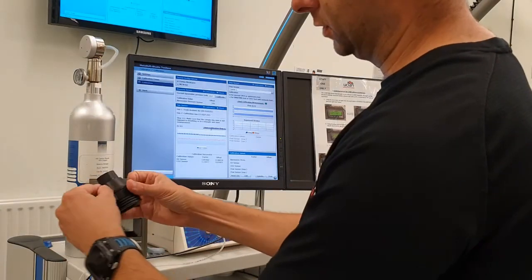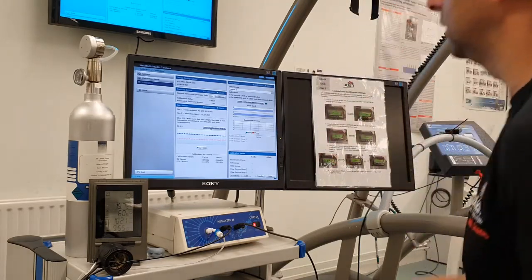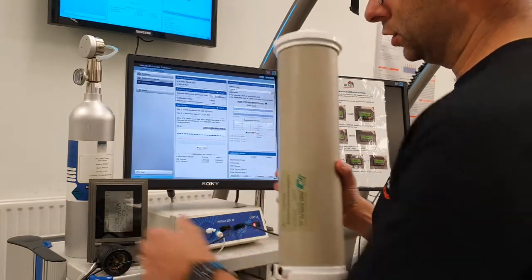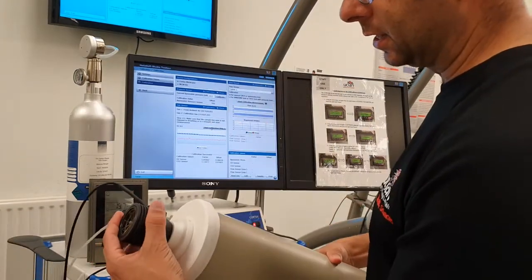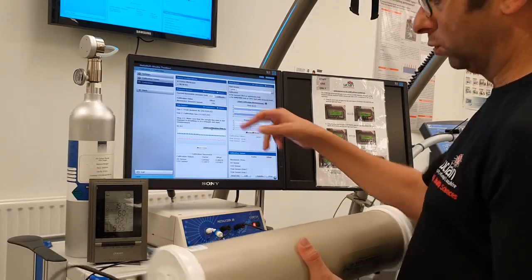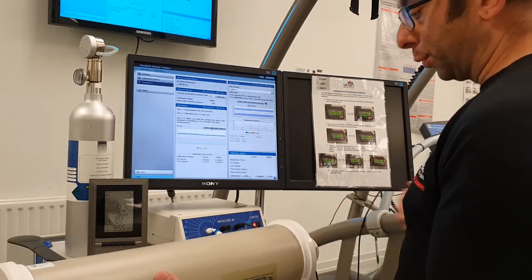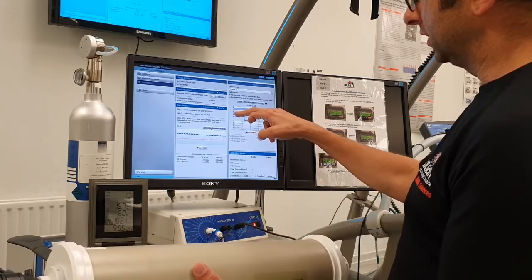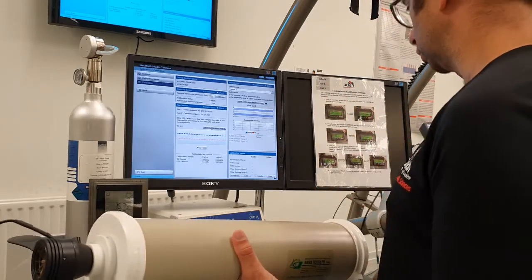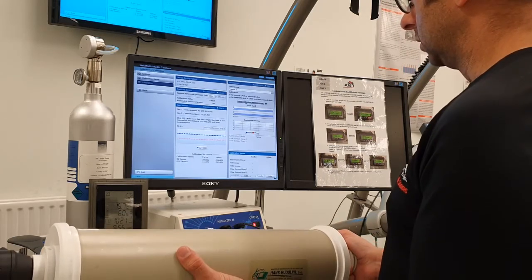Put the feed line back in the pneumotach. The last part is volume calibration. We've got a three-litre syringe — place that in the end there. You'll see two purple bars on screen. You need to draw the syringe in and out, making sure you pull it all the way out to the stop and push it all the way back in to the stop. We want a nice even trace that falls between those two lines, and we need to register five equal strokes. When you're ready, click on Calibration and off we go.